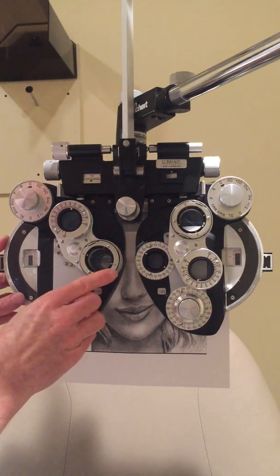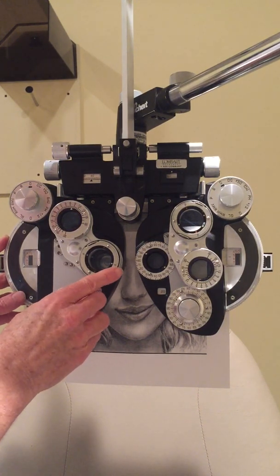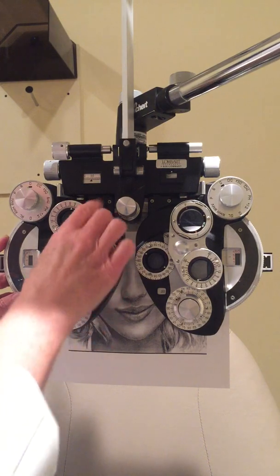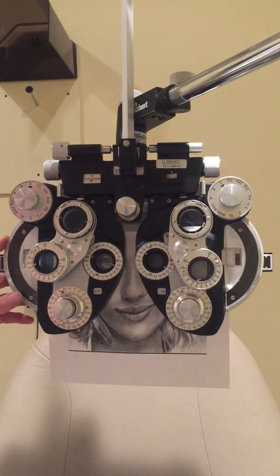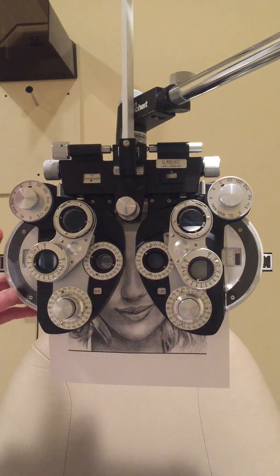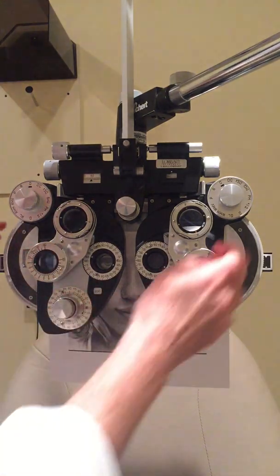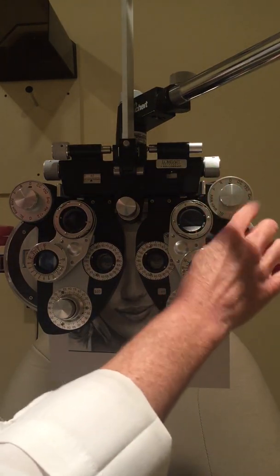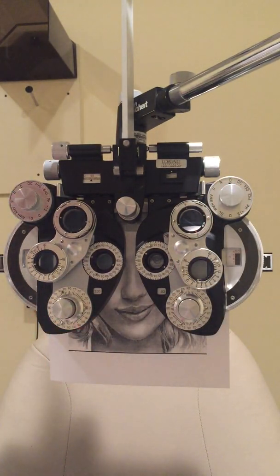After comparing further, she can't decide between positions five and six, so that's my end point. As a beginner check, I confirm she can still read the bottom row — yes, still 20/20 — so I haven't over-corrected. The right eye monocular portion is done. I switch to the left eye, opening it before occluding the right so I don't have both eyes occluded simultaneously, which is very annoying for patients.